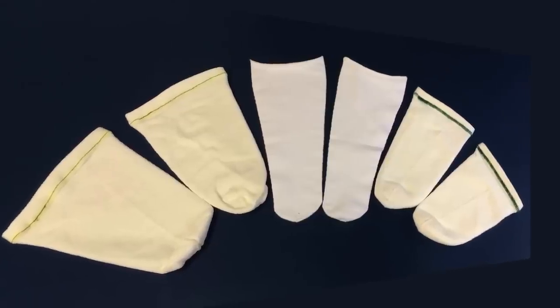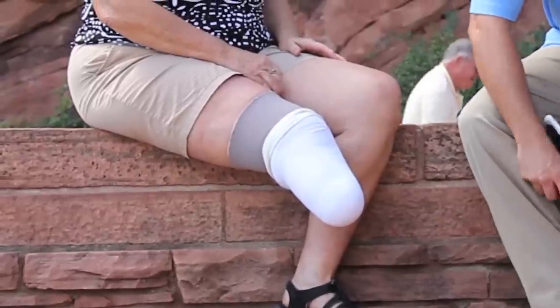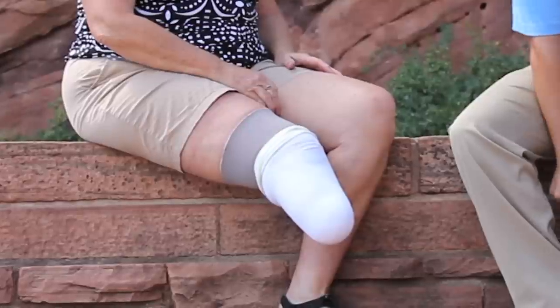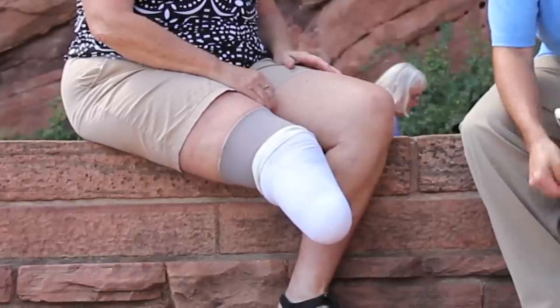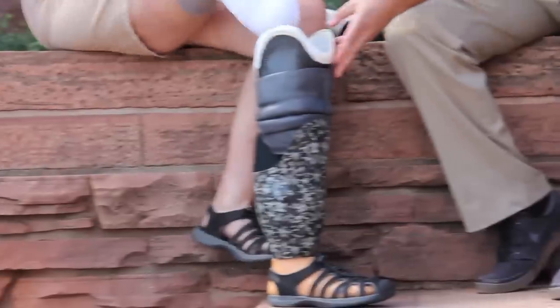You'll receive several socks with your prosthesis. With this supply of socks, you'll be able to better manage your fit. Every time you put on the prosthesis, it's important that you're aware of how many ply you have on. In general, if the socket is loose and your limb slides in too easily, you need to add a sock.